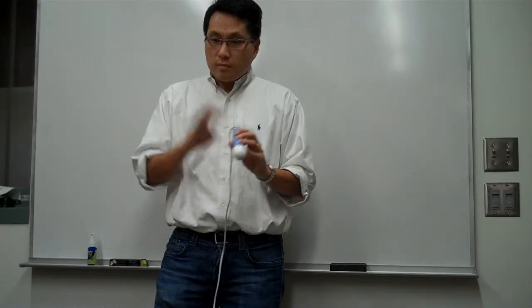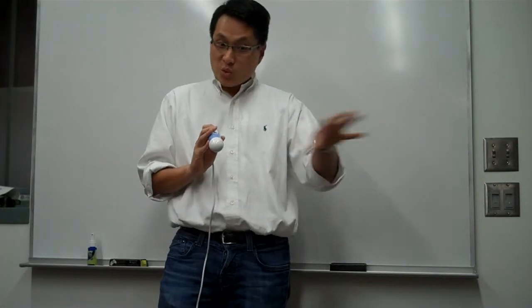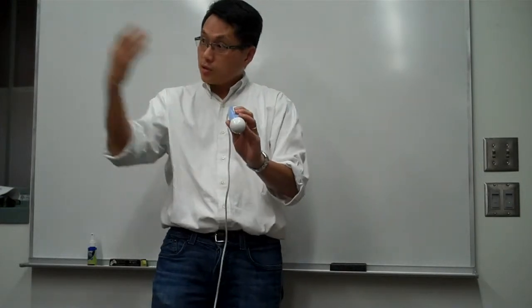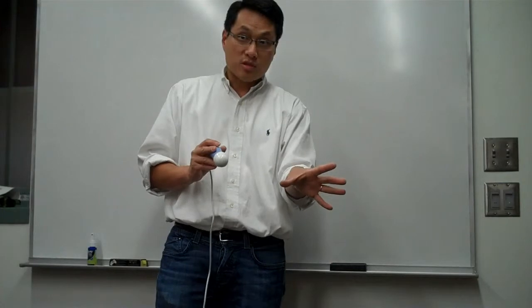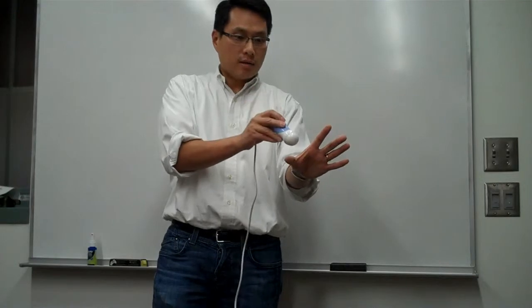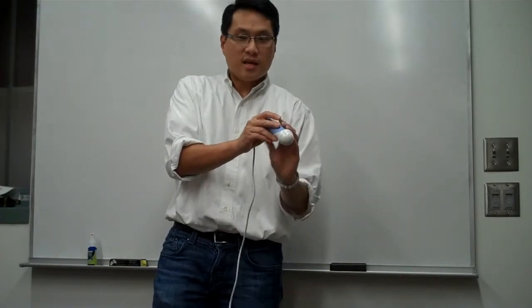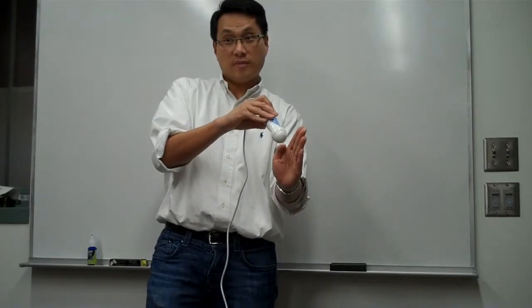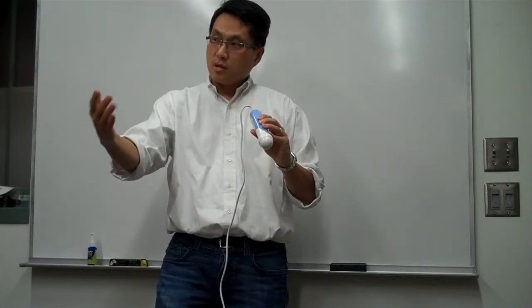Why does that happen? There are three variables: the actual thing you're scanning, the probe position, and the image. You know the probe is a certain way, so you're cutting the slices in a certain way. If there was a way you could actually see, for example, where the baby is and how the baby is positioned, it would be kind of easy, because then you say, okay, the baby's head is here, I'm scanning like this, so I'm getting a cut through this, and that's the image I get. And then I can turn it this way, now I'm cutting the image this way, and that's the image that I get.